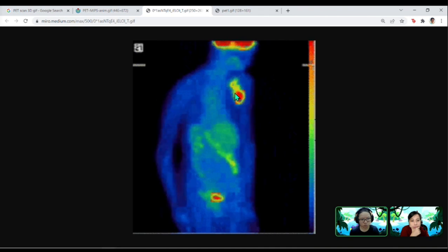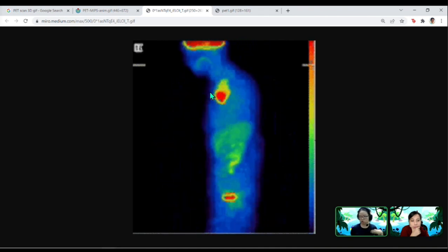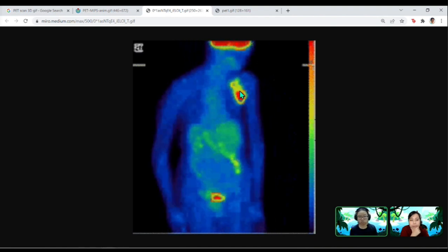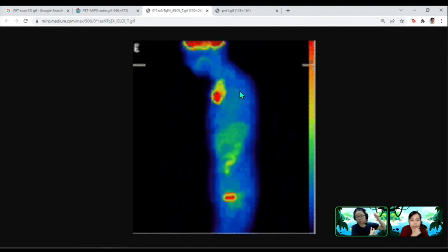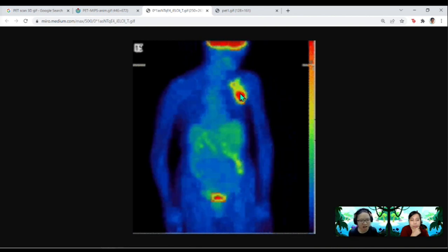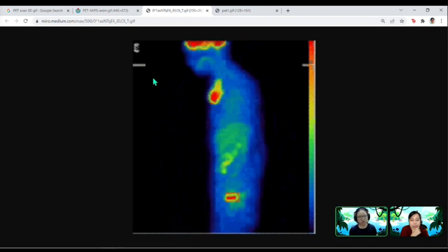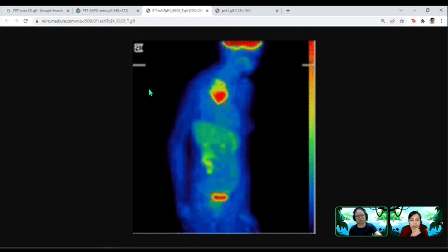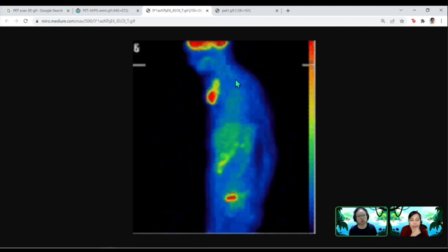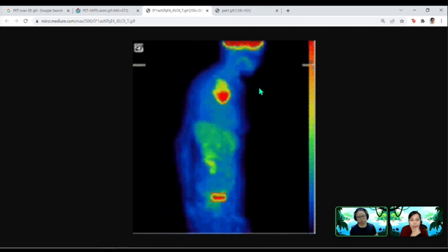So you can see there's a really hot spot right here on the shoulder, because, if you do bio or understand a little bit about human anatomy, a lot of your lymph nodes and your mammary glands are connected underneath your armpit. So it's like, right here. Hot spot. Imagine this person, then the ring is around her shoulder.